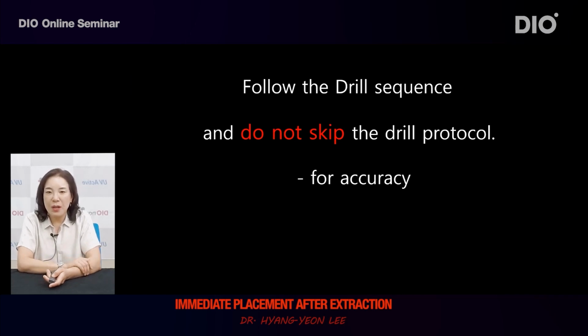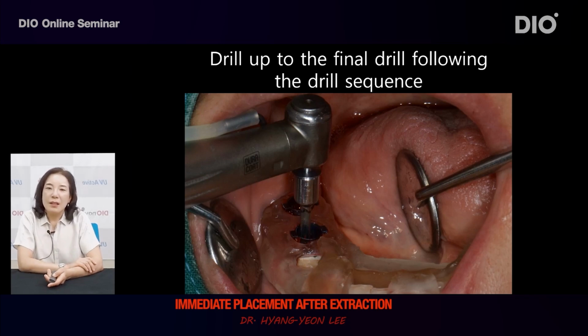Never skip a drill at first. Do not skip, for the accuracy of the drill. After drilling several times immediately after tooth extraction, you can skip if you think it is all right to skip this part. However, the foremost principle is not to skip drills. You must not skip the drill sequence. Drill up to the final drill in accordance with the drill sequence.